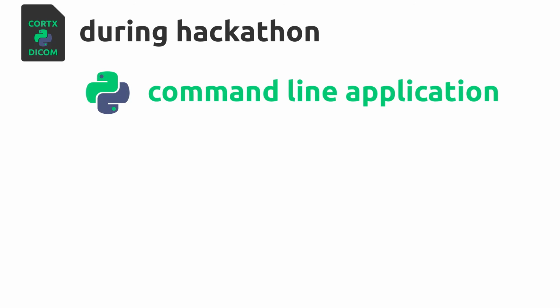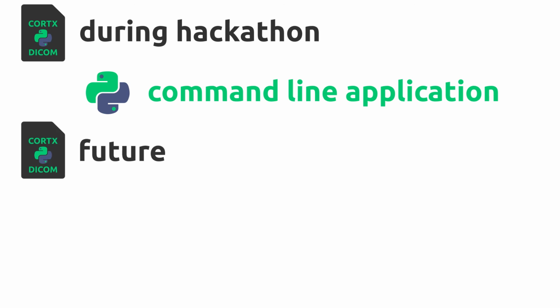During the hackathon, we made a command line application to target the IT staff of hospitals. In the future, it will be good to create a UI-based software to widen the target audience from IT to doctors and nurses. The logic of our DICOM integration is easy to understand.